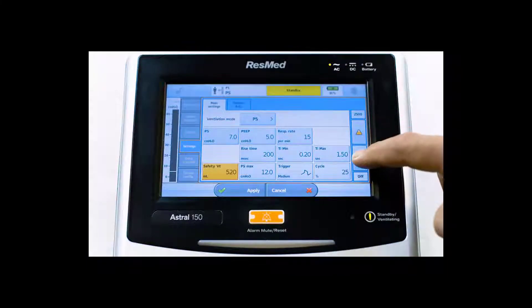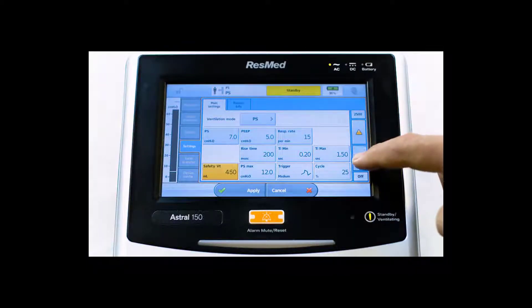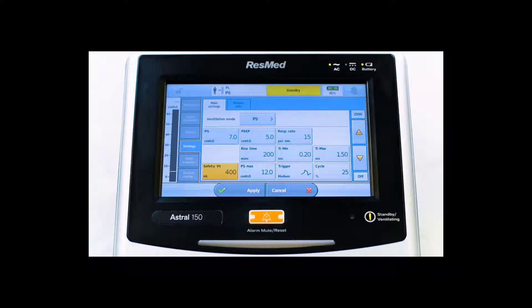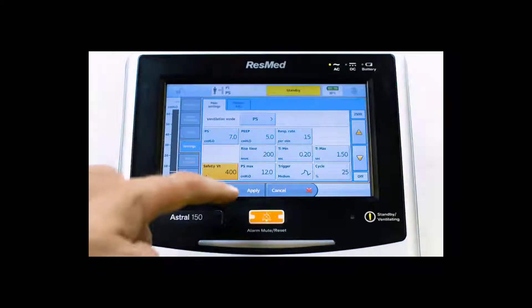This setting is determined by patient height and ideal body weight. Ideally, the setting should be 6 to 8 milliliters per kilogram of ideal body weight for the patient. To save the settings, hit Apply.